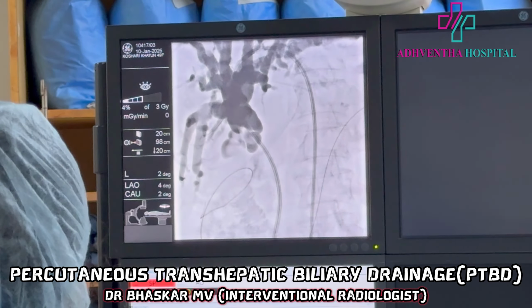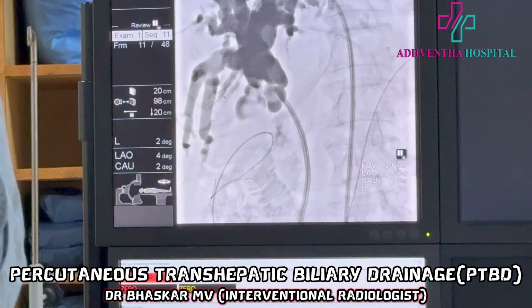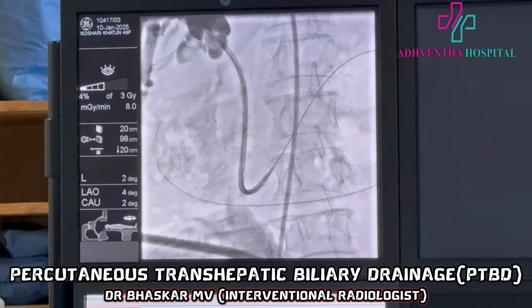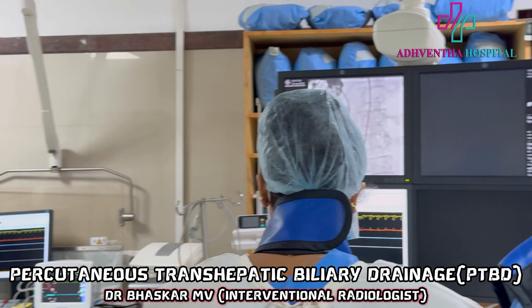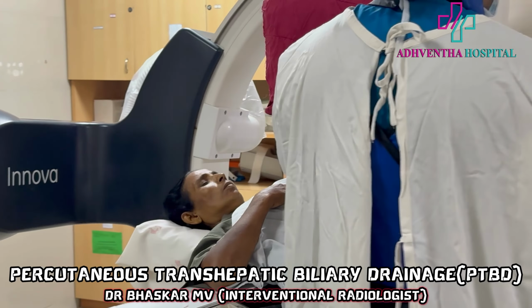Can you show below? Yeah. See? So now the tip is inside the duodenum. Now I'll remove the entire straightener and everything.